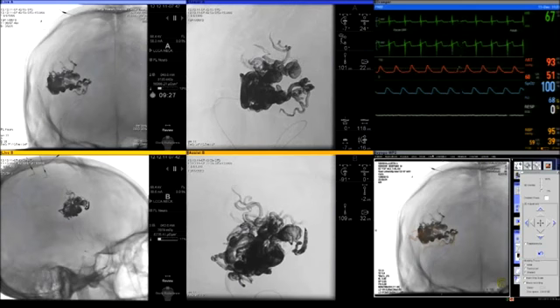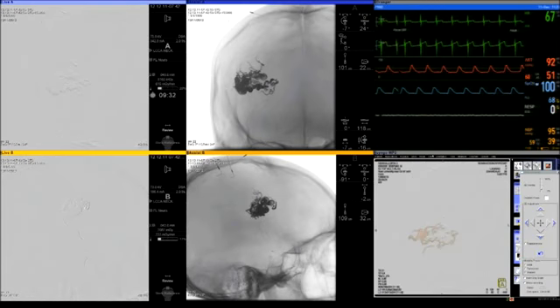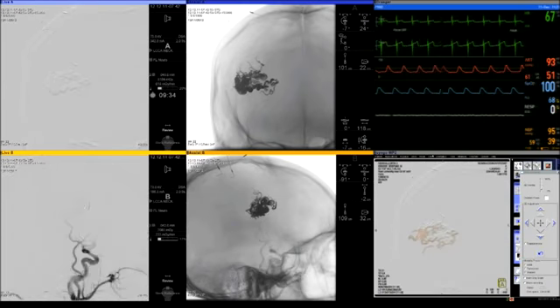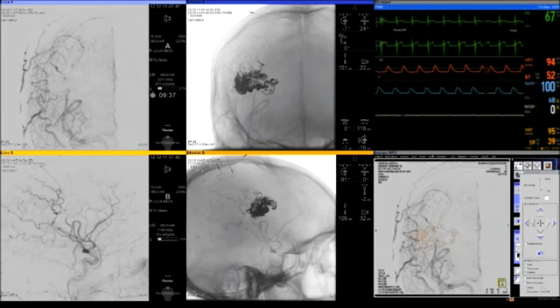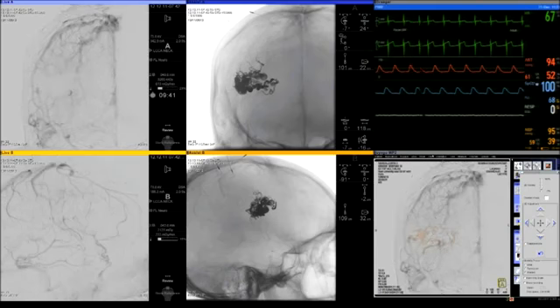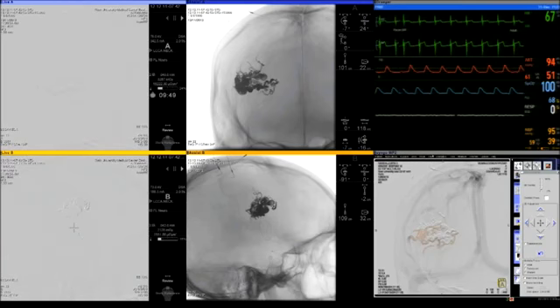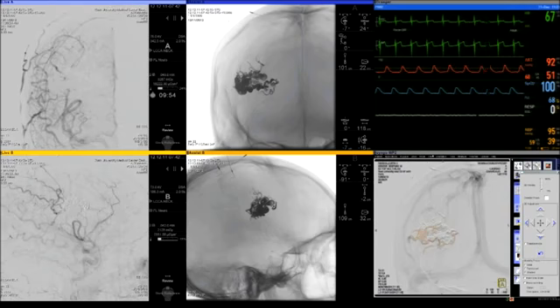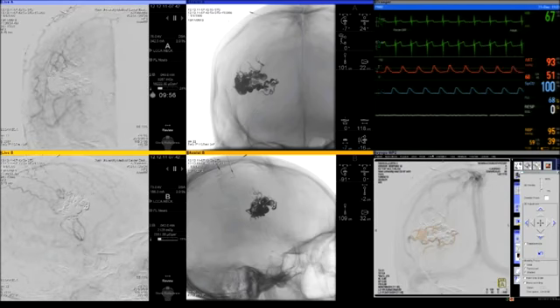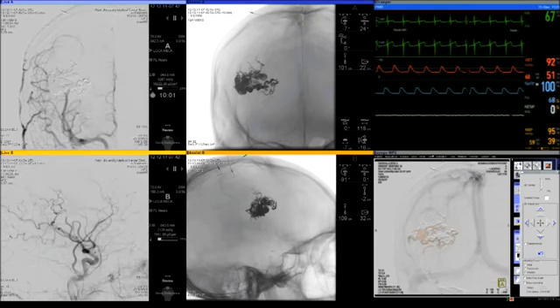If this was not the case, and I felt that I could not embolize anymore, this patient likely would have to go to open surgery to remove the AVM just after the intervention, to avoid the risk of a hemorrhagic complication. We also like to say that these AVMs are only considered cured in our place if they have a complete angiographic occlusion, as well as MRI evidence of no contrast inside of the Onyx cast, or where the nidus used to be.